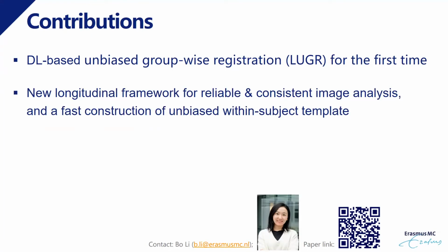Secondly, we further present a longitudinal framework for reliable and consistent image analysis. This framework introduces a novel way for learning-based longitudinal imaging studies and enables a fast construction of an unbiased within-subject template, allowing reliable and efficient analysis of imaging biomarkers.